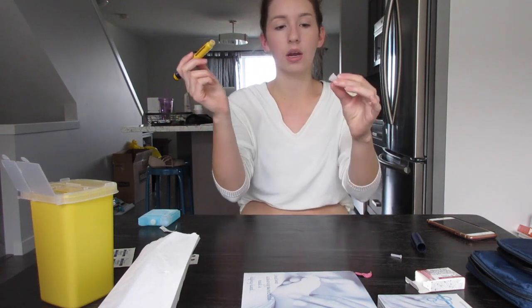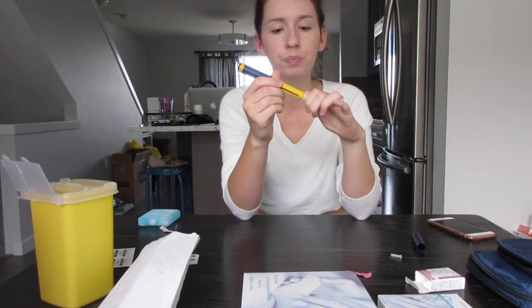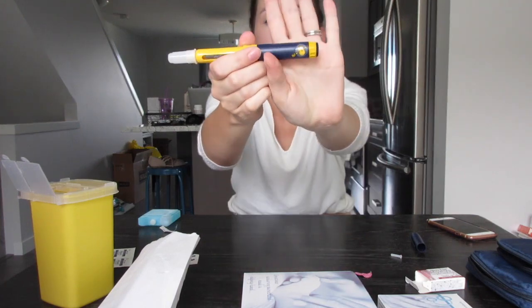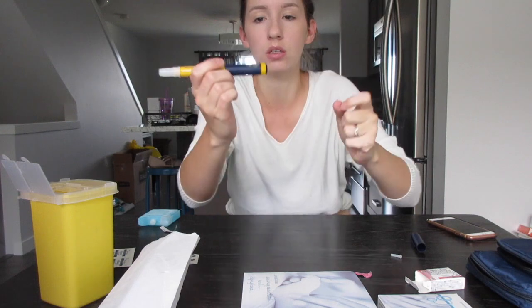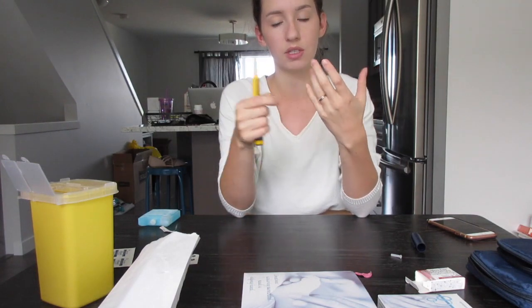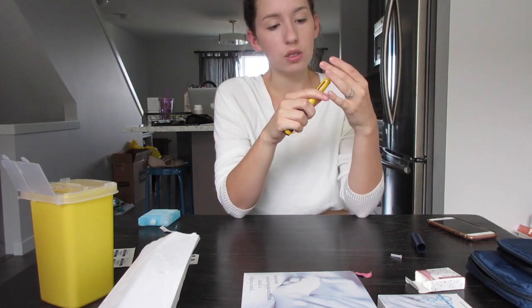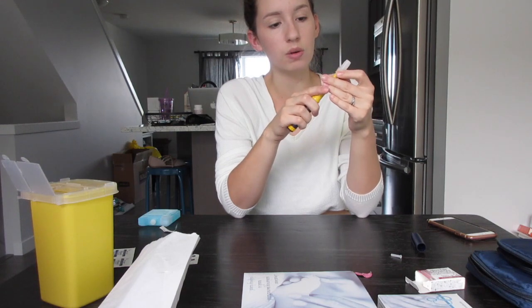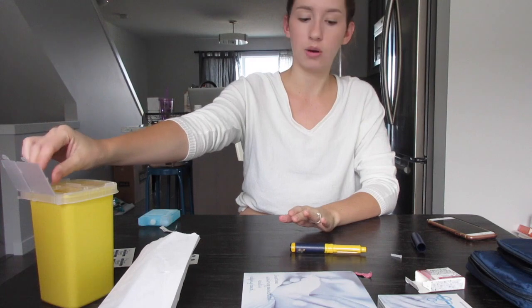And that's that. So then I take my lid, and I put it on, and then I'll start turning. So you can see here that my units is down to zero, which means I got the full and complete dose, which is good, because that means I don't have to do a second needle. So like I said, twist, twist, twist. Sometimes it doesn't come off all the way, so just be gentle while you're doing it in case it doesn't. There it is, and put that right into your sharps container.